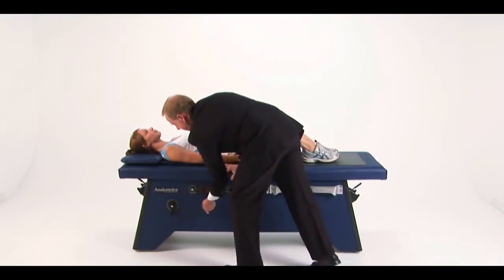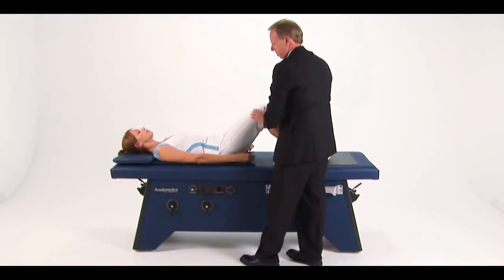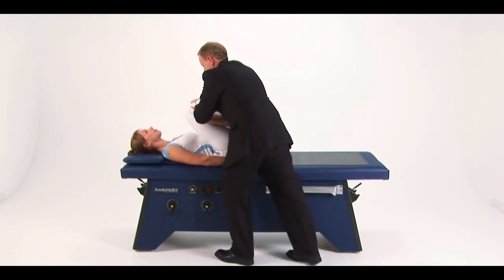For a lumbar sacral separation, raise just the bottom set of back rollers as a fulcrum. Bring the patient's knees to the chest and apply mild pressure as the patient glides towards the head end of the table.